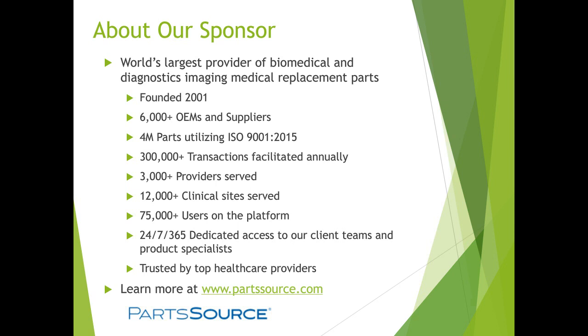Downtime for the devices is not necessarily just about the cost of the part that I'm going to buy. Especially in CTs, for every hour that machine is down, we're losing, not just for internal profit, we go on $1,500 an hour. So me saving $200 on a part, but it's going to take me an extra 8 hours to get the part, is not cost worthy. So we look at that a lot and balance it against the department's actual operational time and utilization of the devices.